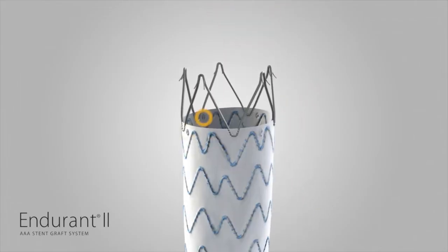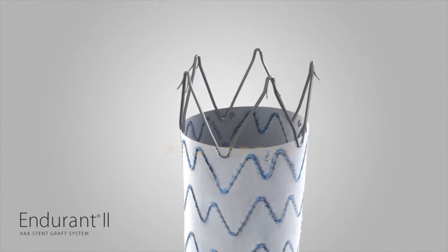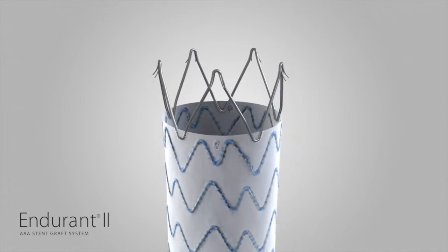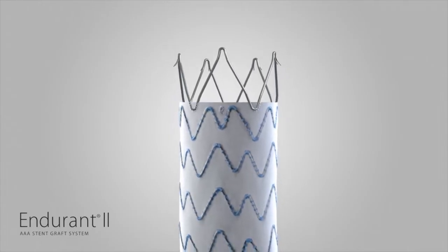There are four radiopaque markers at the proximal end of the stent graft fabric. The edge of the graft fabric is one millimeter above the top edge of the radiopaque markers. Adjust the position of the bifurcated stent graft such that the top edge of the graft fabric is just below the lowest renal artery.